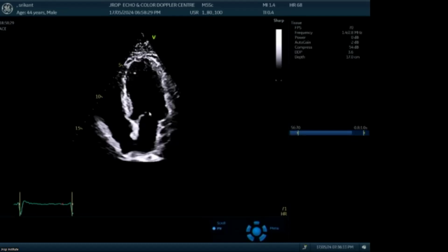Thank you, sir. There are techniques with which we can accurately measure the mitral valve area by planimetry. We have machines with multi-planar transducers. What the machine will do, I'll show you in a second. This machine has the same technology with which we cut right at the tip of the mitral leaflets. Amazing technologies, but they cost a lot. That's the only problem.